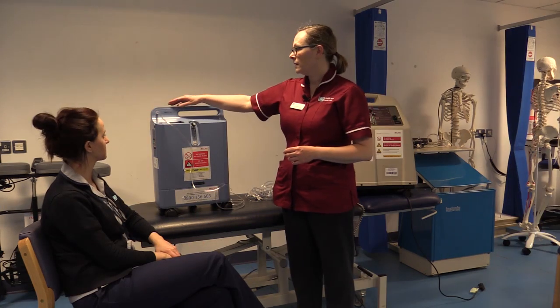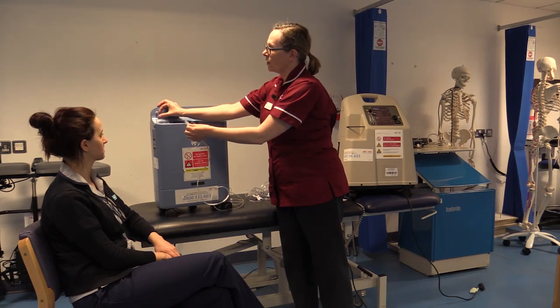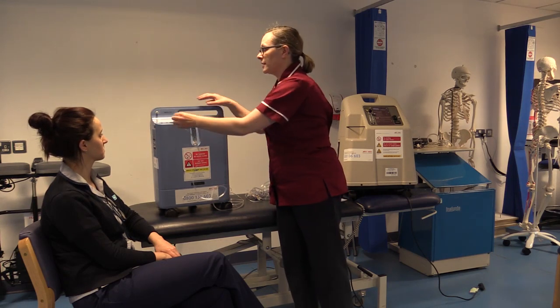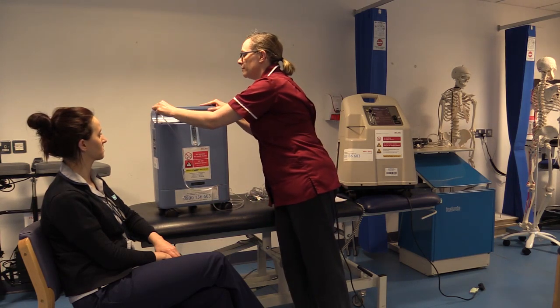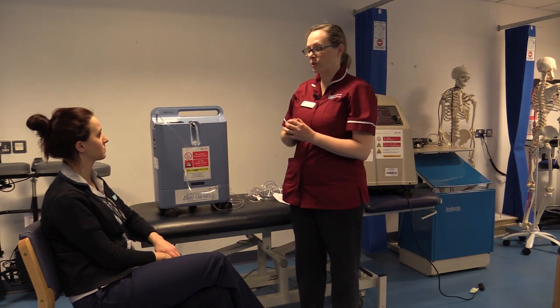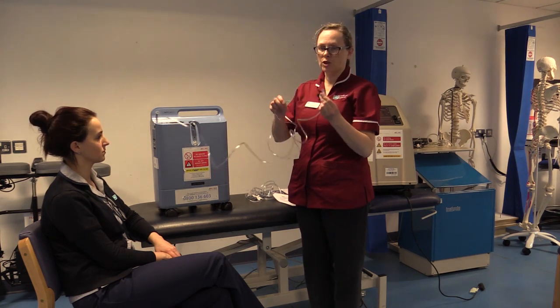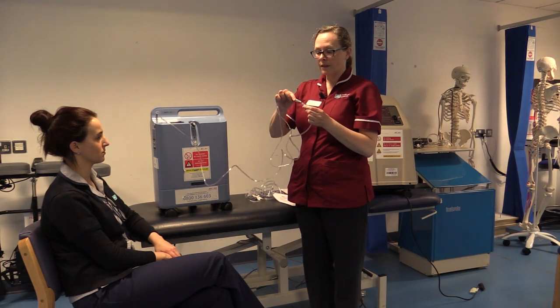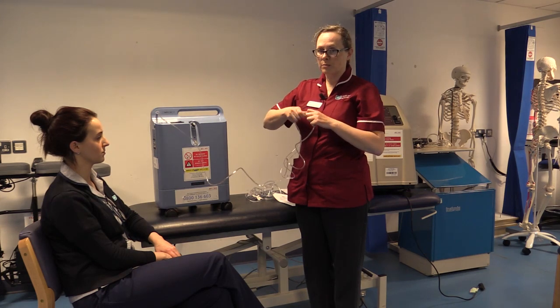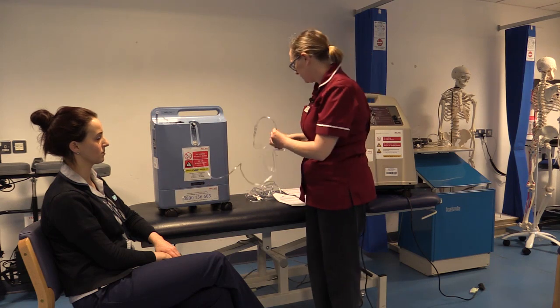So between the tubing and the machine, there will be what we call a fire break. This will be a white connector about this long with an arrow on it pointing what direction the oxygen will travel. There may also be one between your tubing and your nasal cannula. These must not be removed and should be always in place. This will prevent a fire from travelling up the tube.